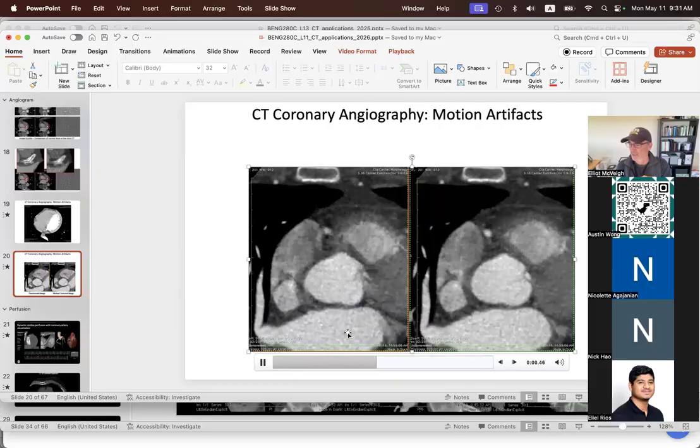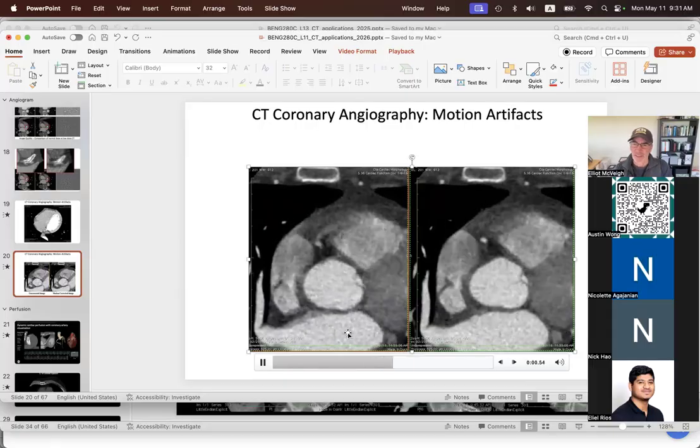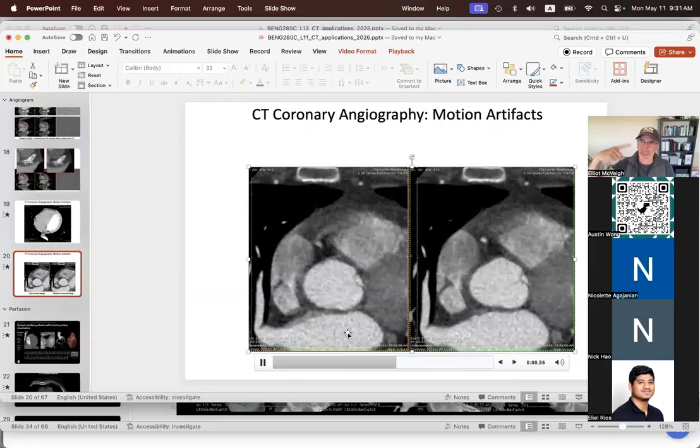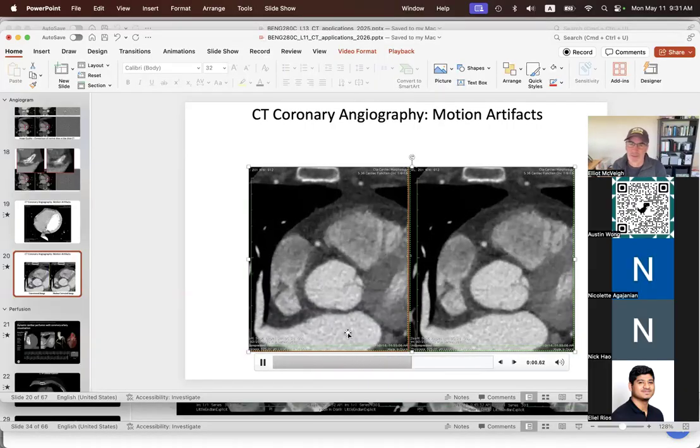So every 100 milliseconds, you click along and look to either side and say, okay, I'll take 150 milliseconds of my most recent data around this point, and I'll make a picture there. Because the gantry, recall, is just spinning around and around, and so you do continuous gantry spins and just make images at some time interval.